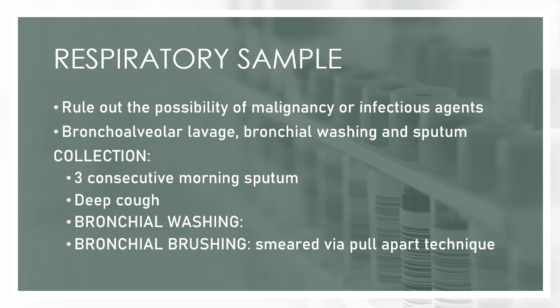This morning sample is the same as the preparation for DSSM, direct sputum smear, in case of tuberculosis. Morning sample, deep cough. So three consecutive morning sputum, and of course it should be a deep cough.